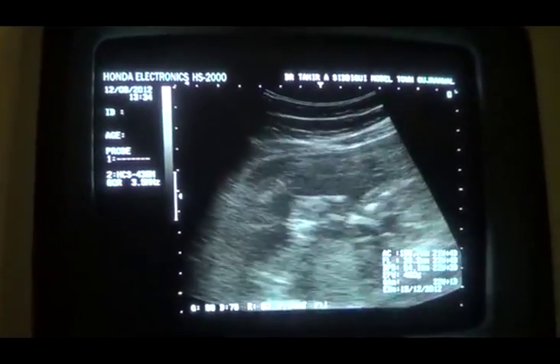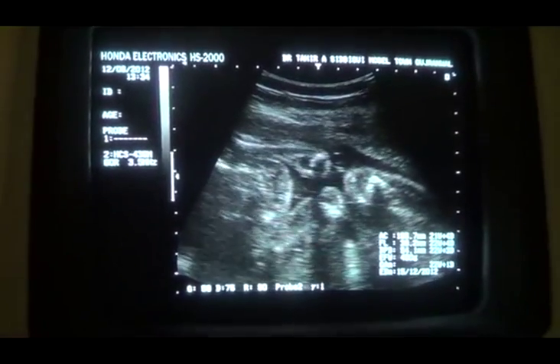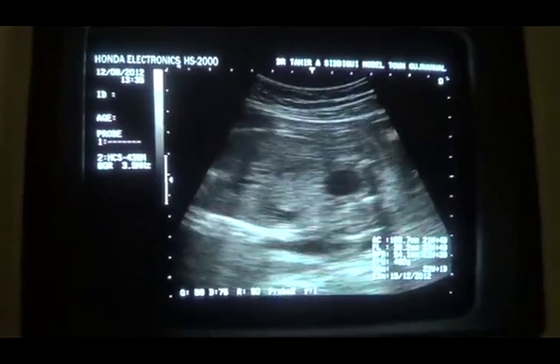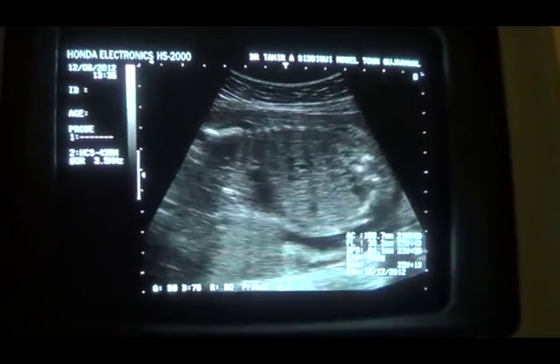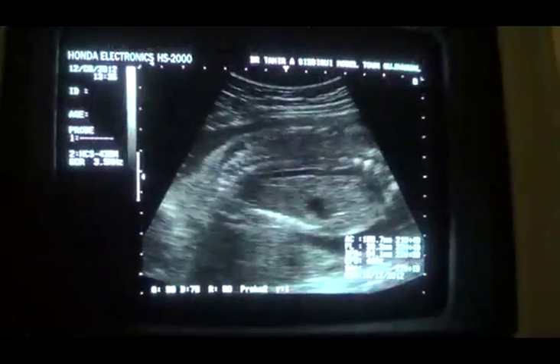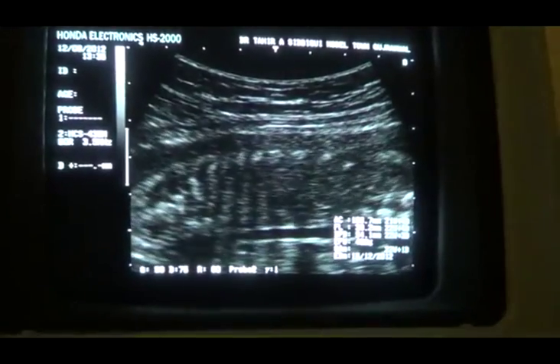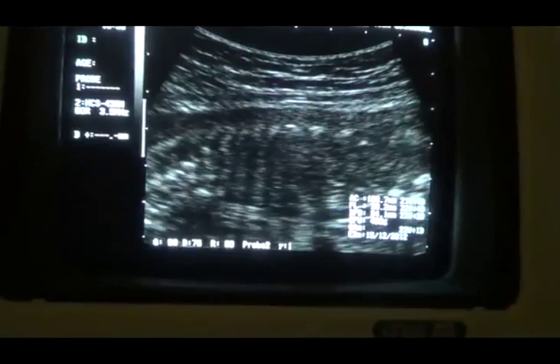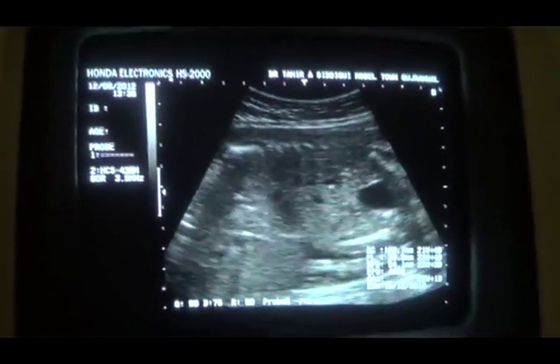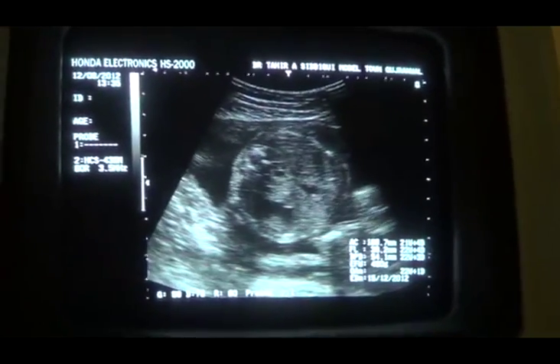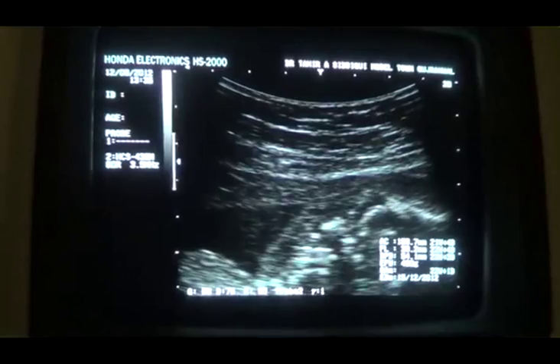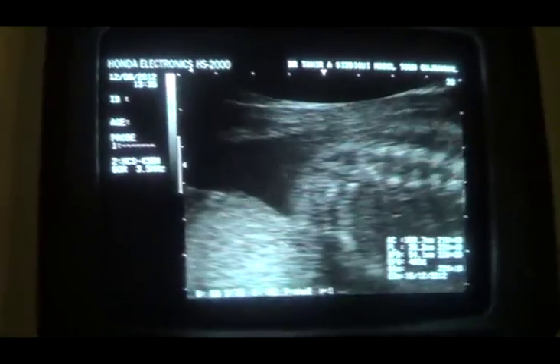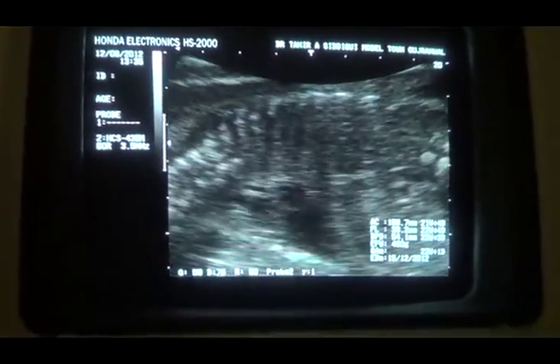This is a normal study at 22 weeks. The presentation is breech. These are the limbs, lower legs. This is the aorta of the fetus — this is the aorta — and you can see its pulsations.